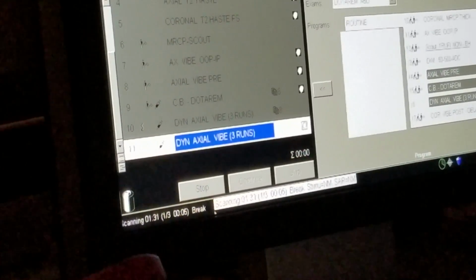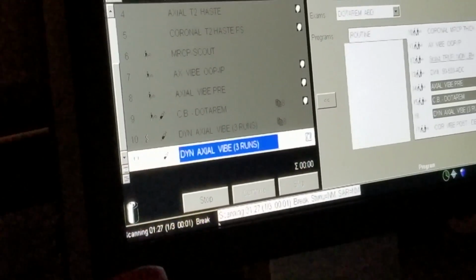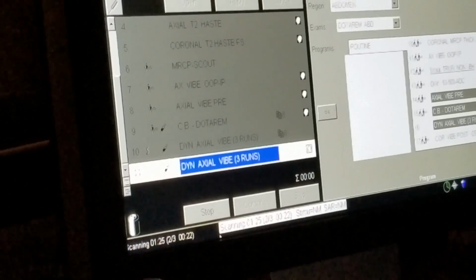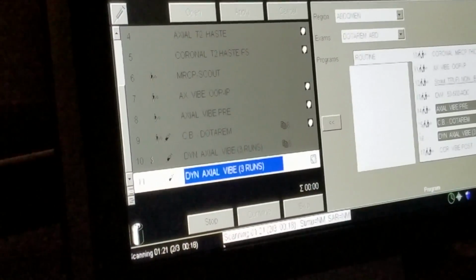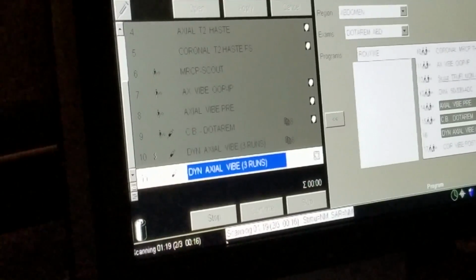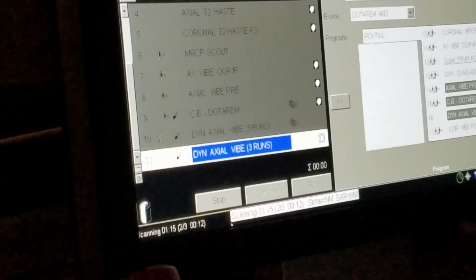Okay, Sarah, take a breath in and hold it. Don't breathe. Scanner starts on its own. So if you answer a phone call, if you're talking to somebody, it's super easy to get distracted from that little clock, and the scanner's going to start without you.